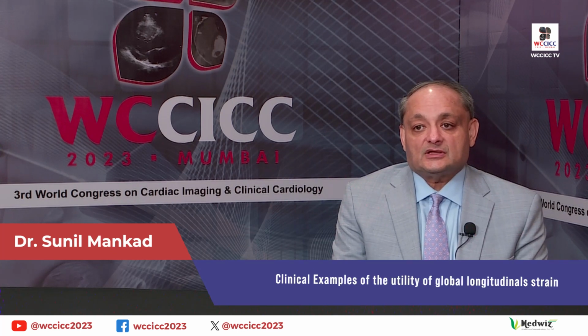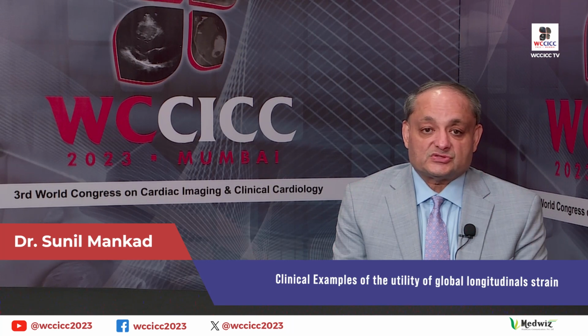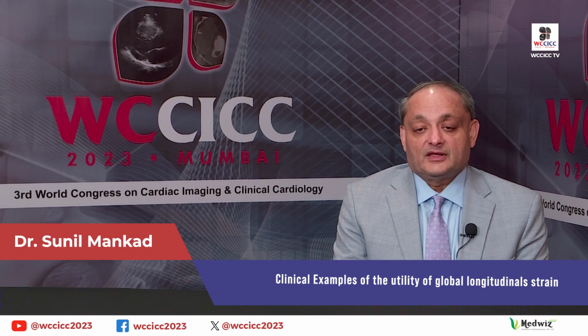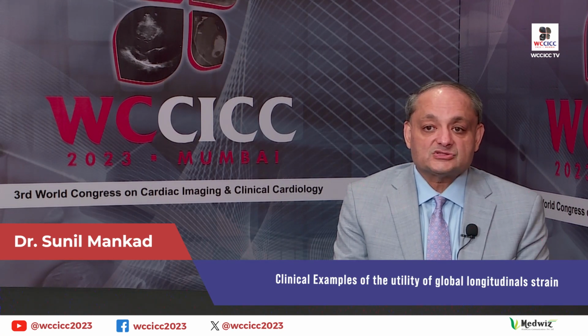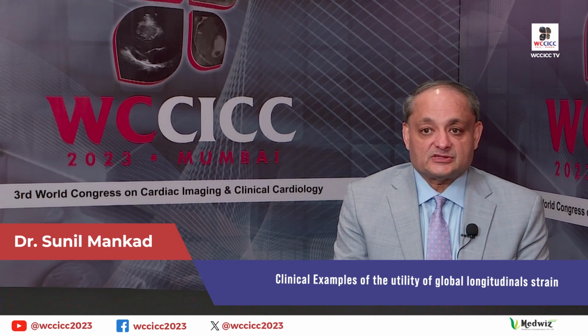And in addition, even though current guidelines may be met in patients with severe mitral regurgitation, you can unmask subclinical LV dysfunction by fixing that mitral valve, and you can detect that early subclinical LV dysfunction better with strain imaging than you can just looking at the size of the ventricle or the ejection fraction.